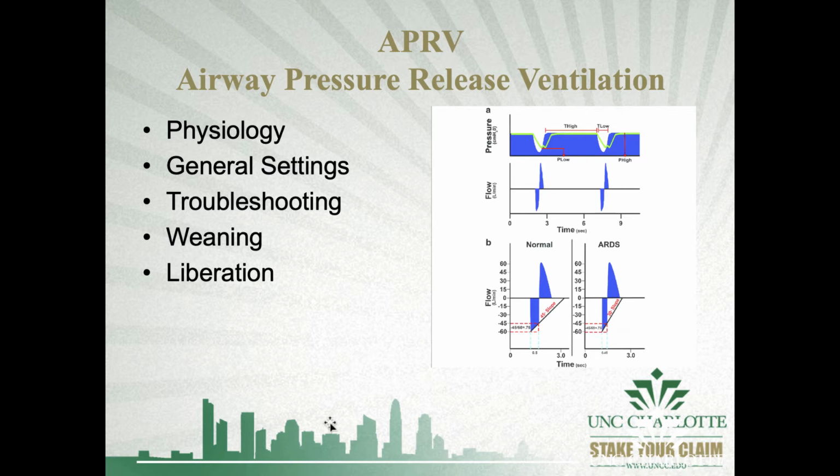It's a double-edged sword. Now, finally, with your T low, obviously, if you increase that to mitigate hypercapnia, you can cause de-recruitment and lung injury, so induce VILI, okay? So you have to take all these things into consideration with a grain of salt. So let's talk about hypoxemia.